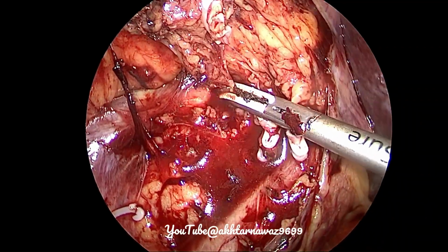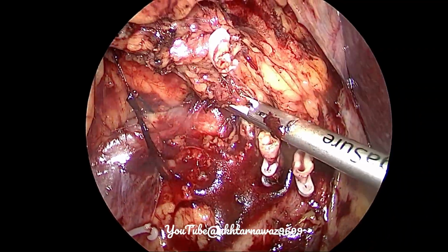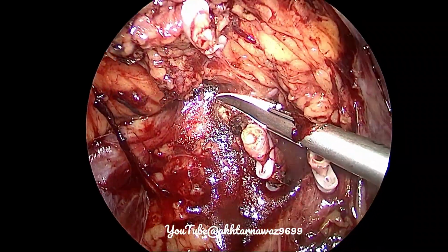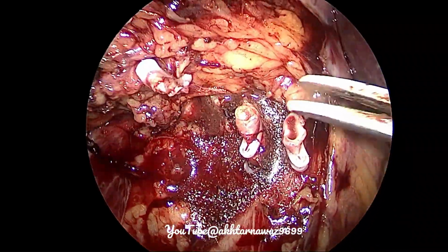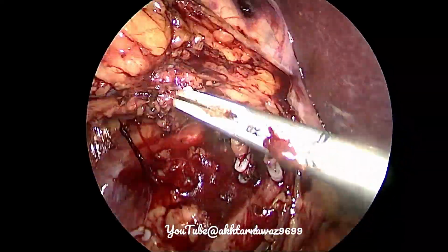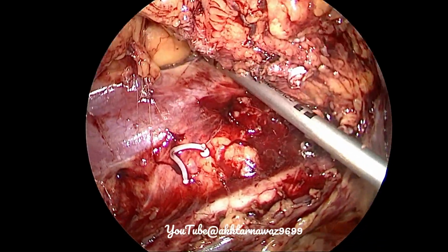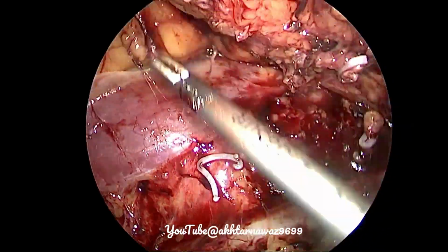of the procedure. Remember not to leave such kind of clips, especially the Liga clips, because they are notorious for migration into the gut. It can cause abscesses and so many things.